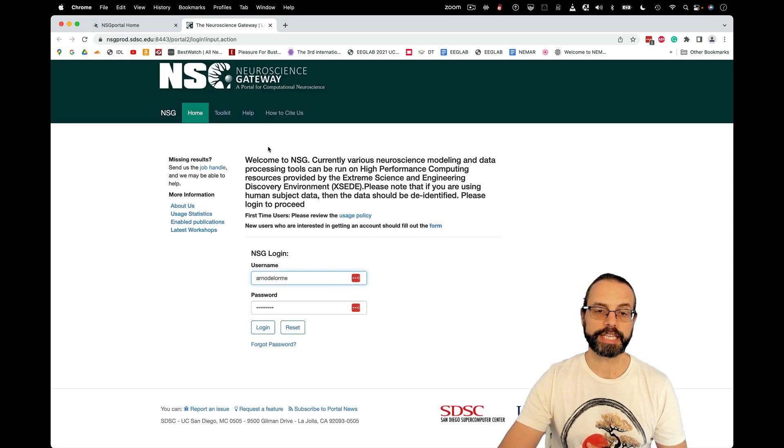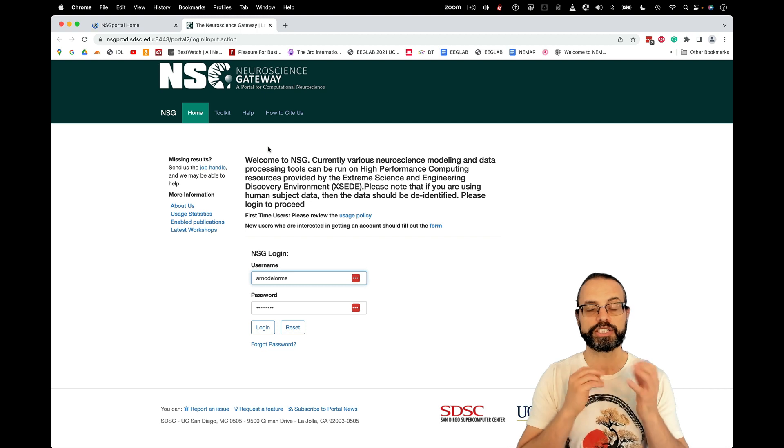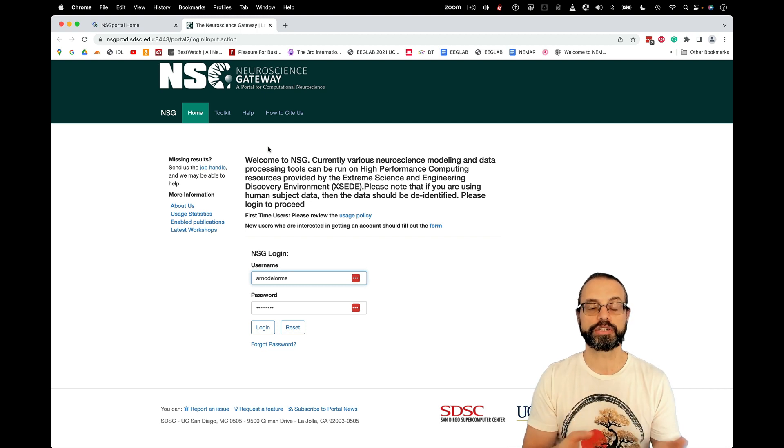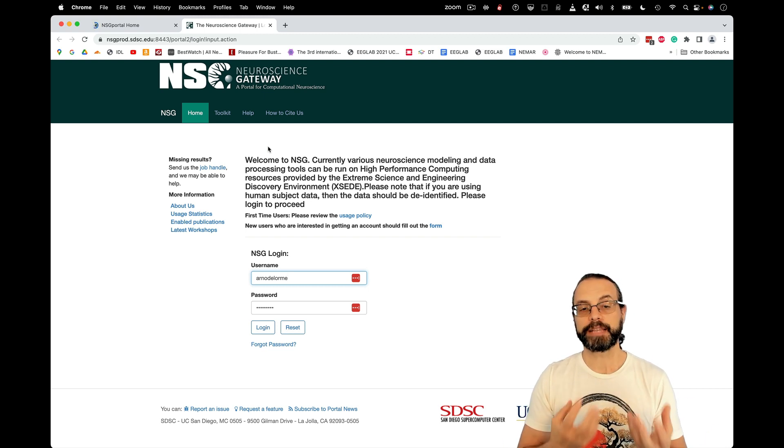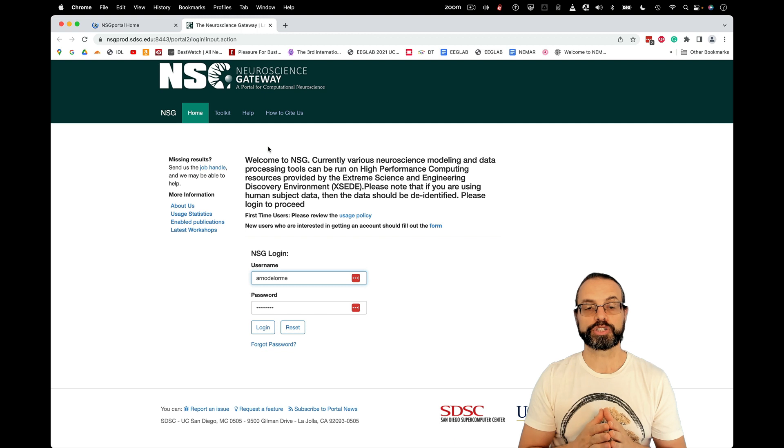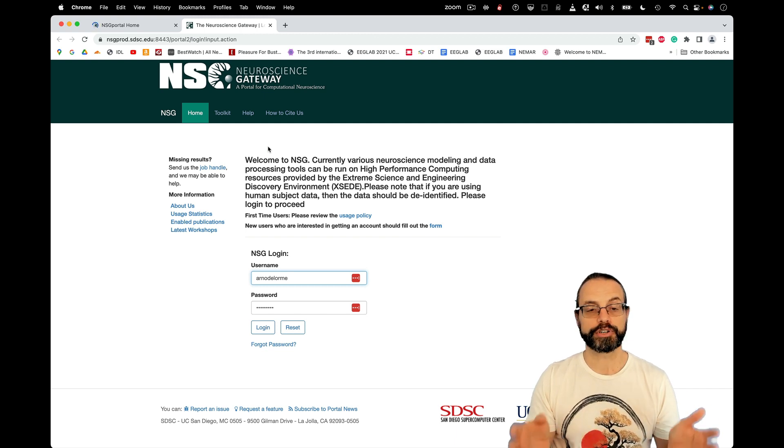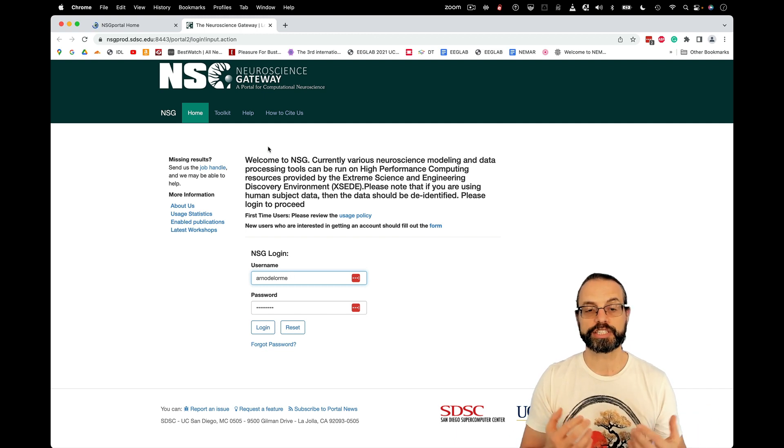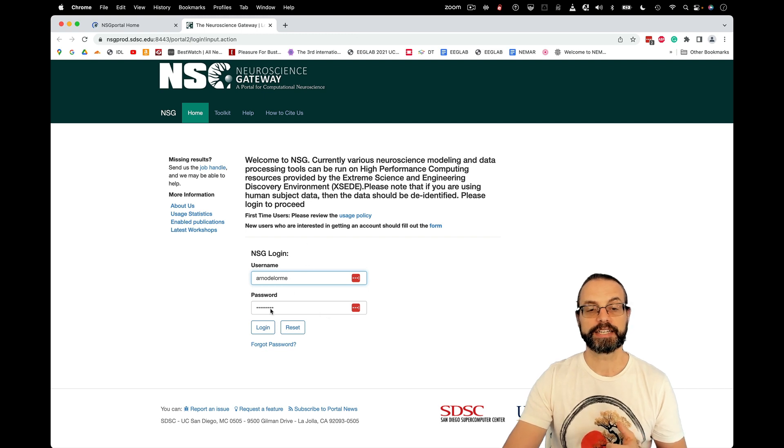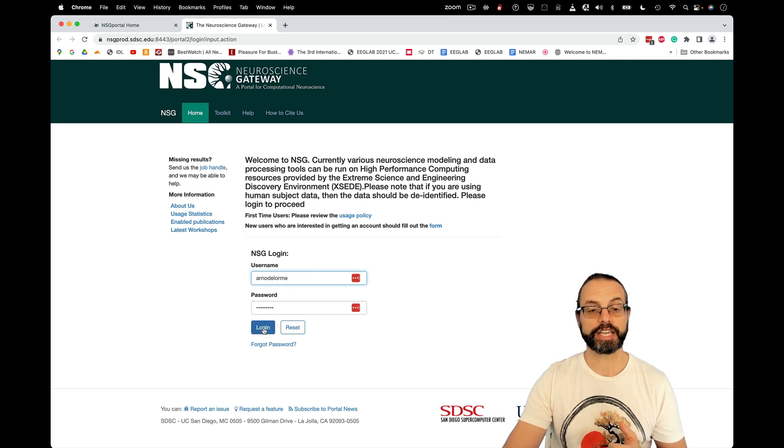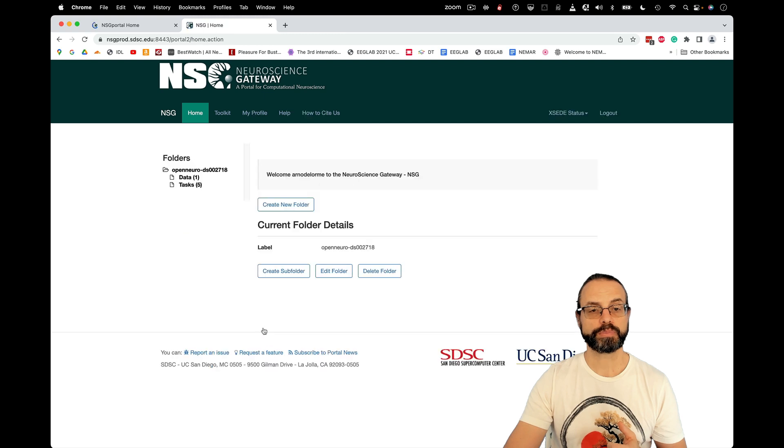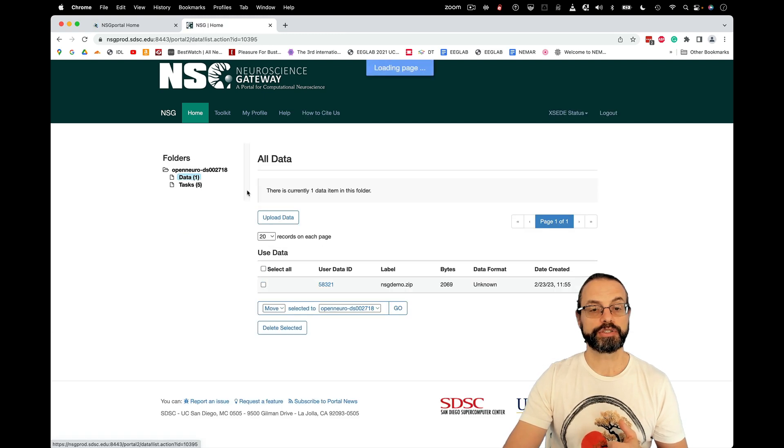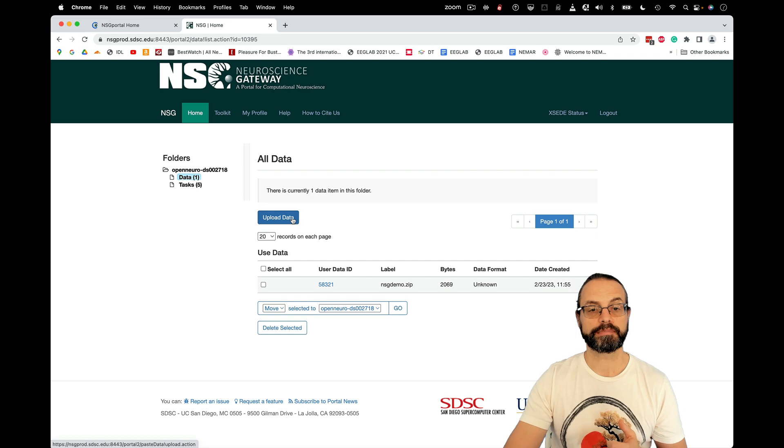And here I need to log in. So if you don't have an account yet on NSG, you will need to register to obtain an account. Anybody that works for a non-commercial entity anywhere in the world can register for an account. And these are manually vetted. Once you have an account, you can log in.